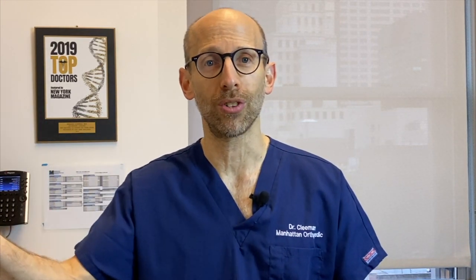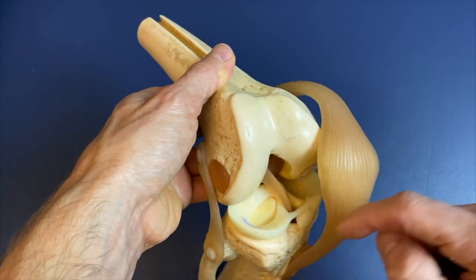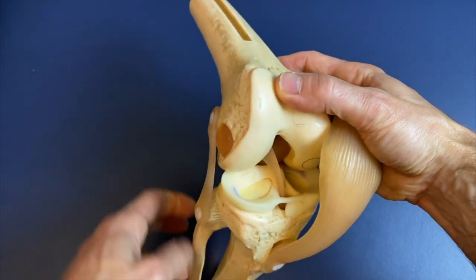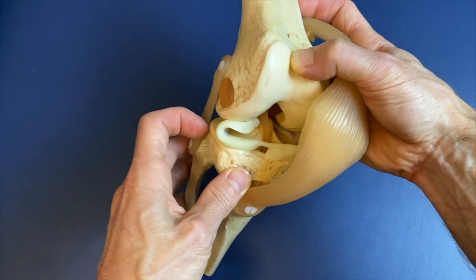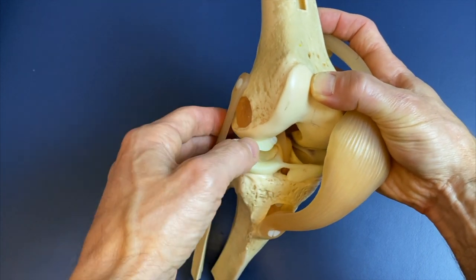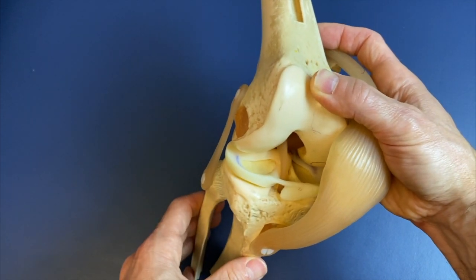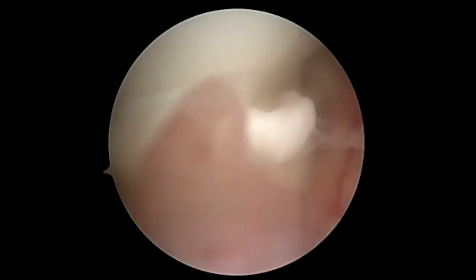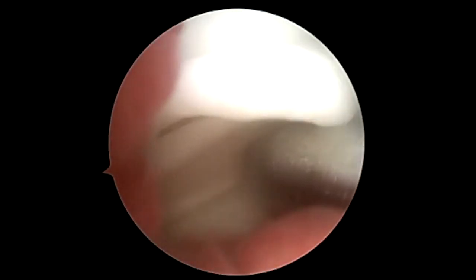If we can return the anatomy to its normal state, we can help prevent arthritis from occurring down the road. This is a model of the knee — thigh bone, leg bone, and the meniscus, which is this cushion here. Sometimes the meniscus will tear and flip — that's called a bucket handle tear, which blocks the ability for the knee to extend all the way. During surgery we have to flip that piece back and then put our stitches in to repair it. In this arthroscopy video, that flipped bucket handle meniscus is blocking our view into the joint.